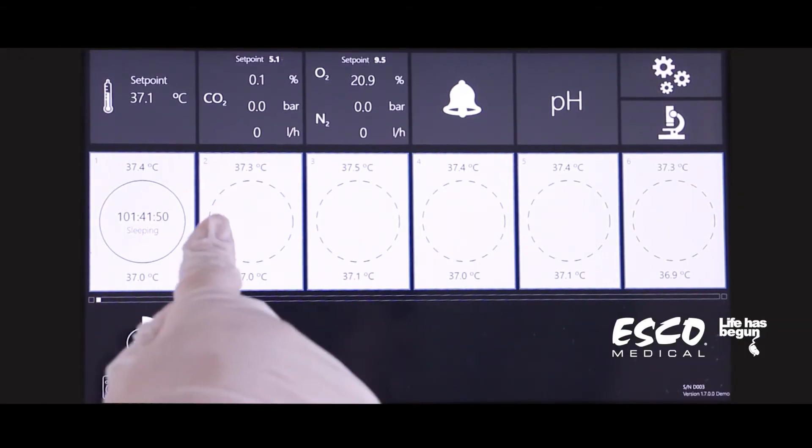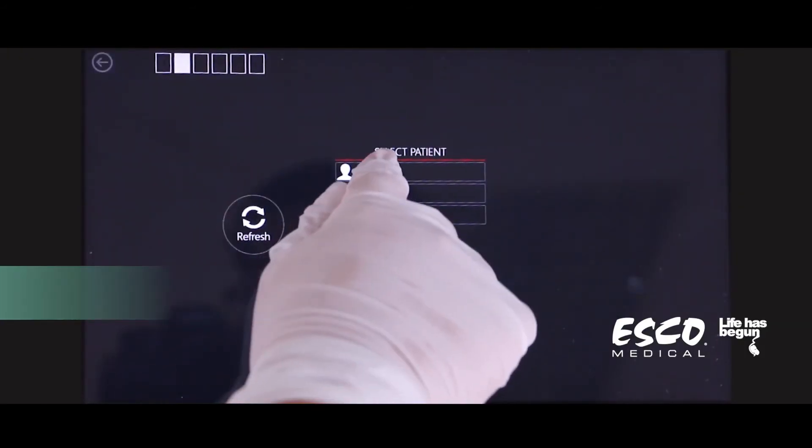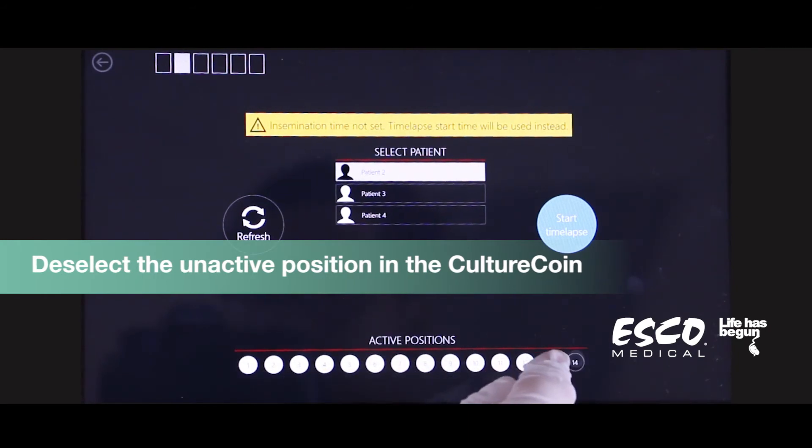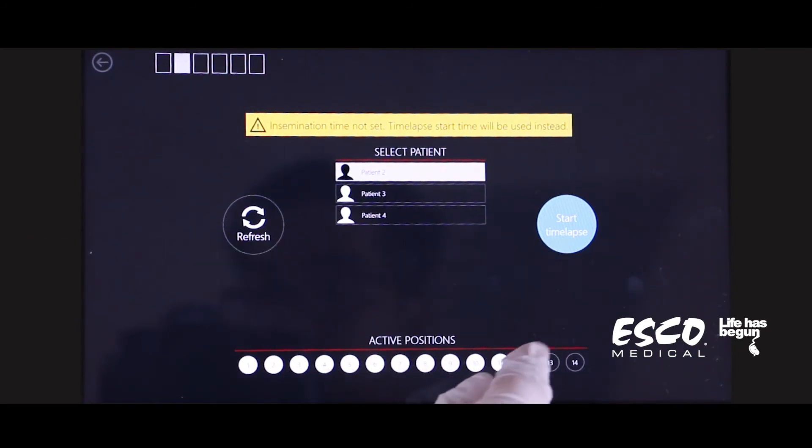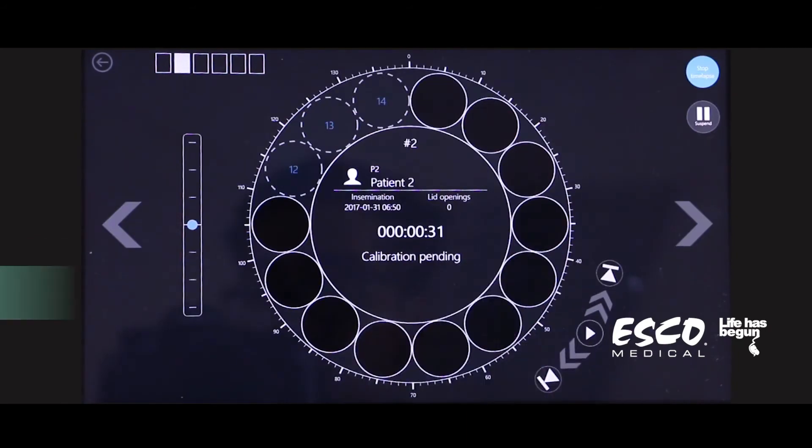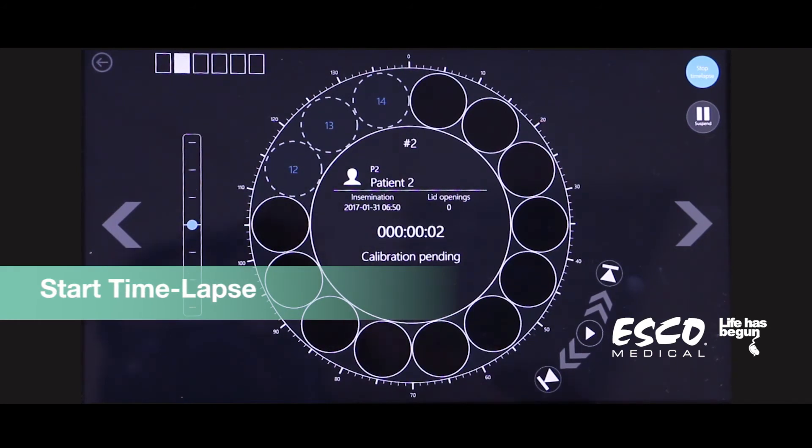The system will then prompt you to select patient. Afterwards, deselect any unoccupied or unused positions in the culture coin. Once ready, start time-lapse.